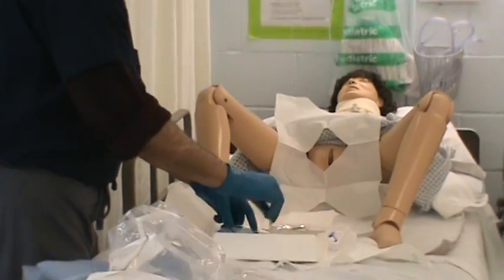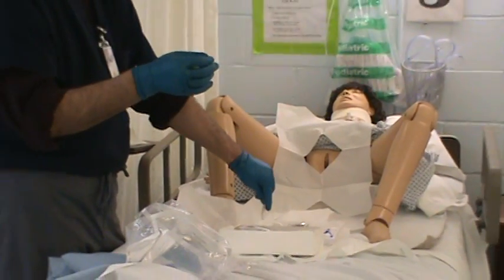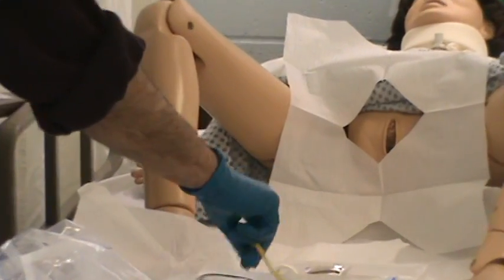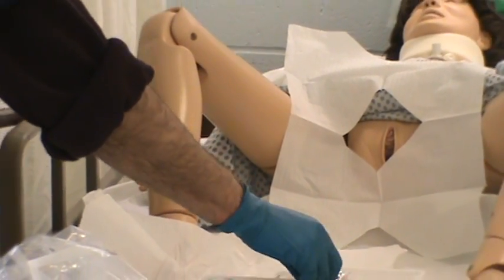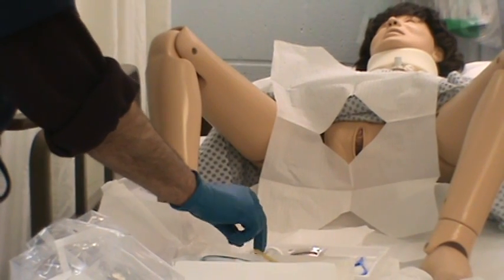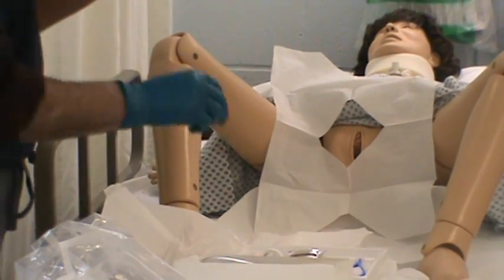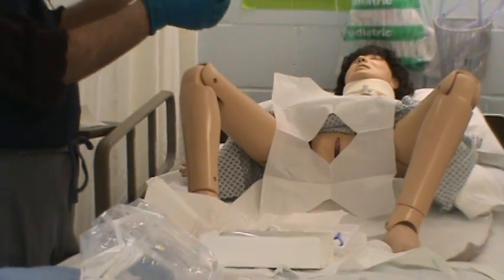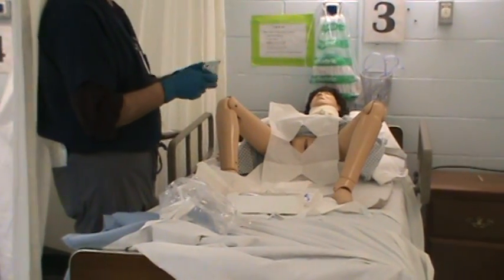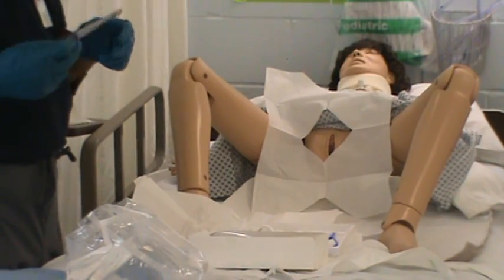I have my lubricant. I'm going to open my lubricant and spray it in this little container, then lubricate the tip of my catheter. I'll set it back in the box — it's all sterile in there and I know it's going to be safe. I'm going to rip open this Betadine iodine pack. You should also ask the patient: are you allergic to iodine or shellfish? Because then you couldn't use this — you'd have to get some other type of antiseptic.